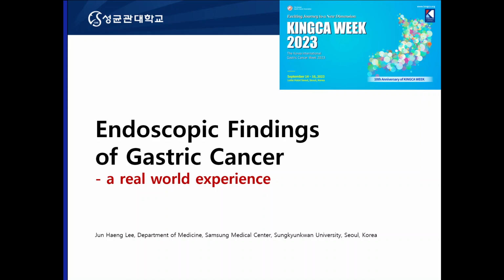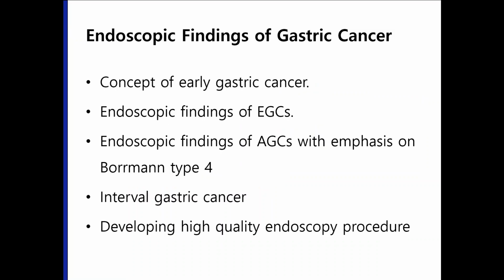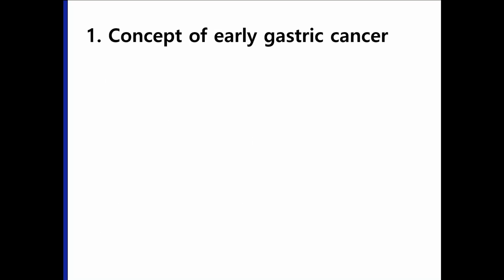Today, I'll talk about some aspects of endoscopic diagnosis of gastric cancer. Today's topics. Let's think about the concept of early gastric cancer.